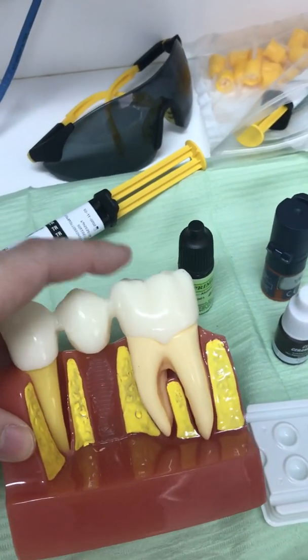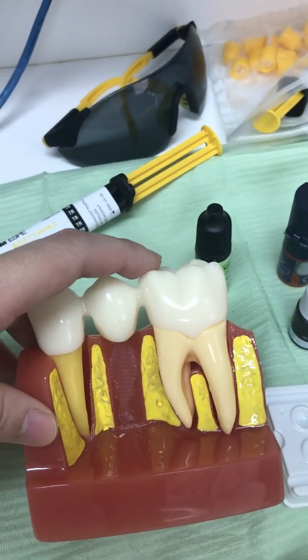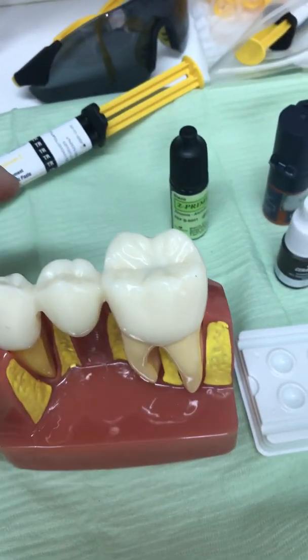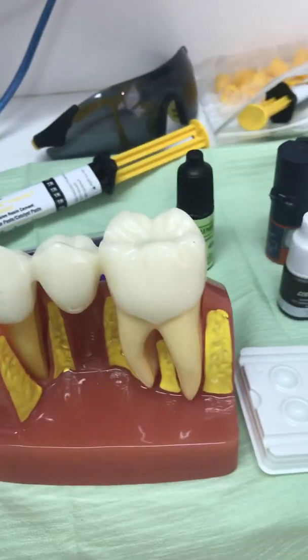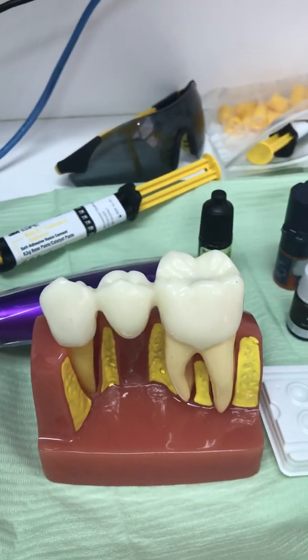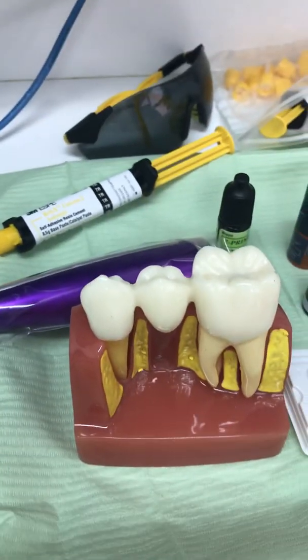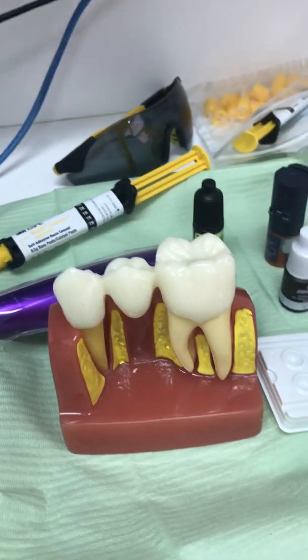To speed up the curing process, we use an LED light cure on the outside and inside surface of the crown. Generally when the six minutes is up, we check the bite, and that will be all for the cementation.